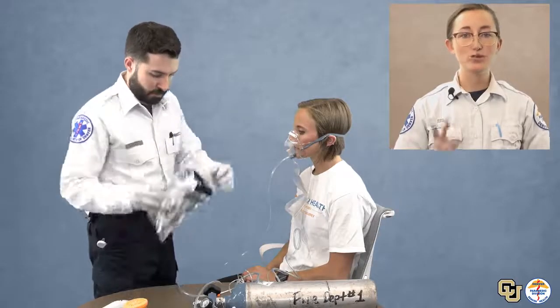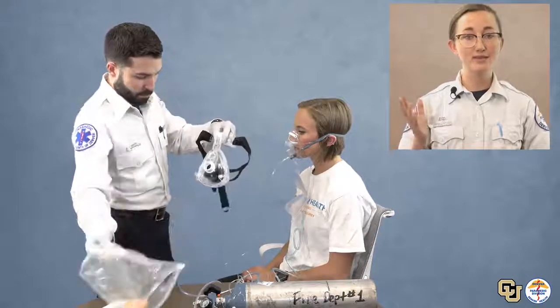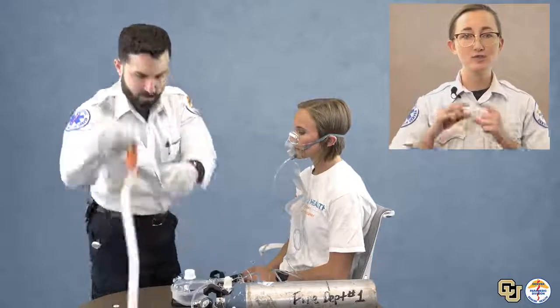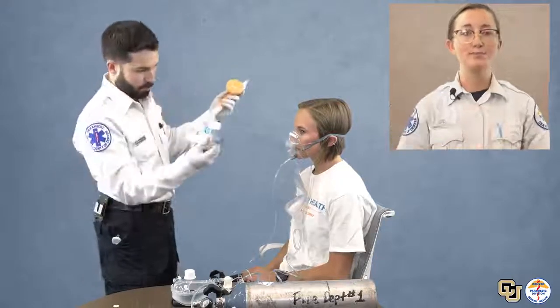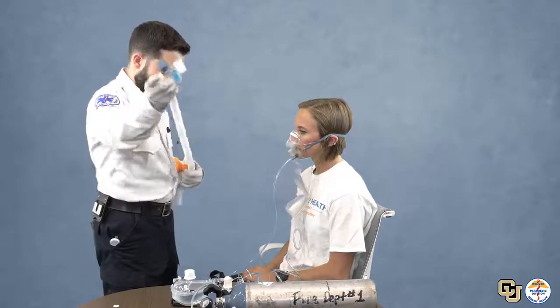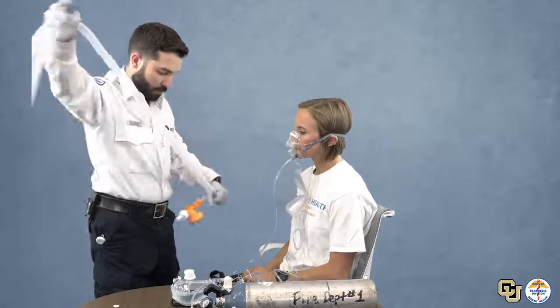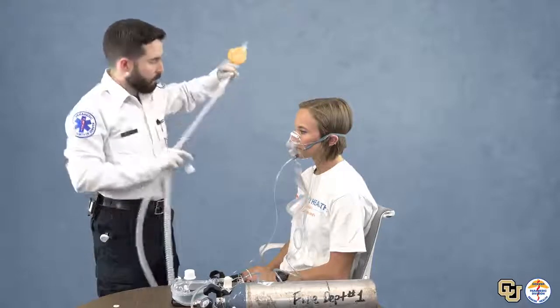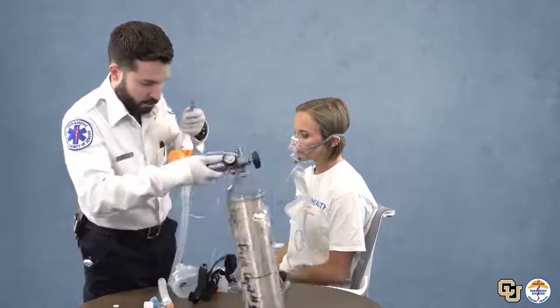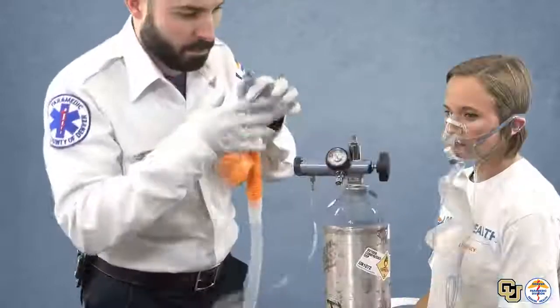This CPAP comes with two components: the face mask with an attached forehead stabilizer and straps, and a corrugated expandable tube with an attached bacteria filter and PEEP valve. We are going to attach the oxygen tube located at the end of the corrugated tube directly to the oxygen source on the wall or oxygen tank. A 50 psi source is essential for the CPAP to work, so let's not attach it to the flow meter.